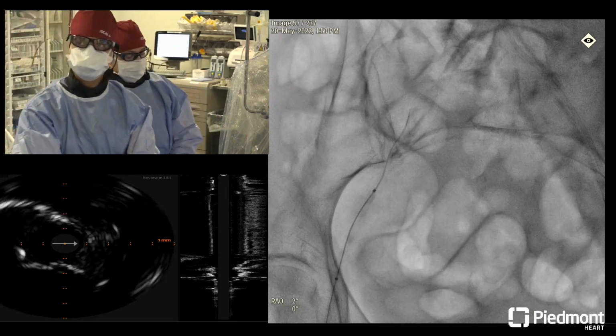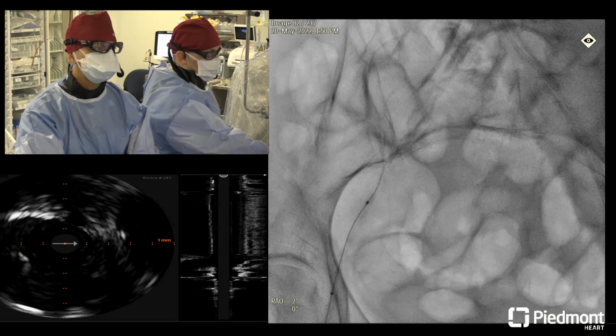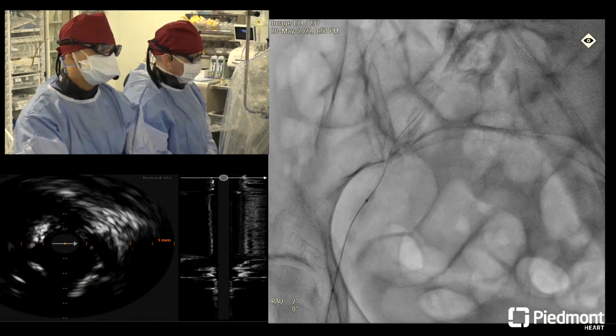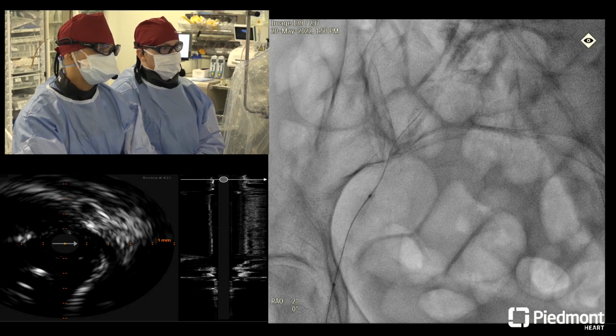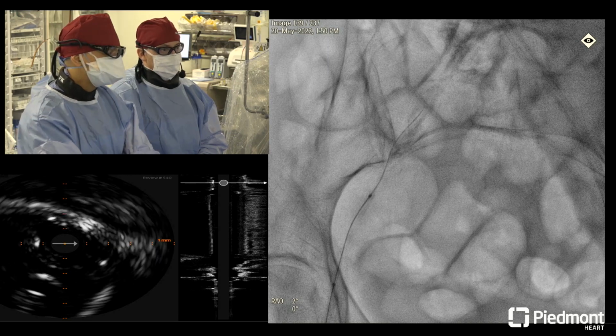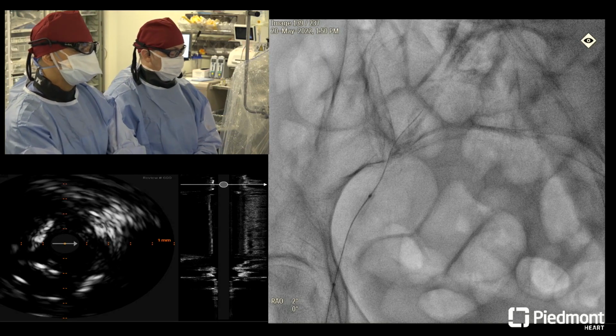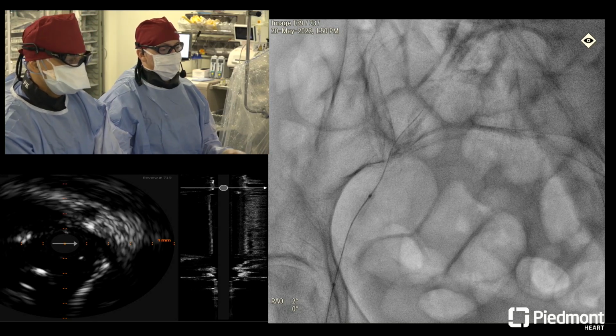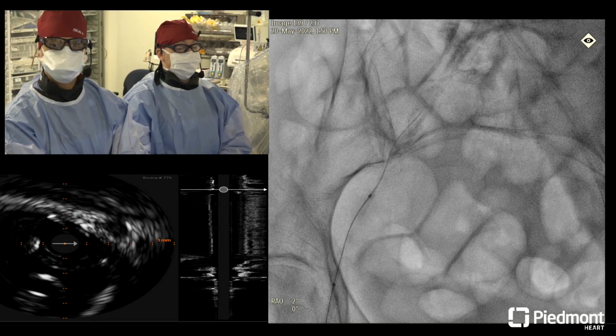So you all did have the right radial for the diagnostic angiogram. Did you consider reaccessing that and then taking an R to P down that way for an additional retrograde shot at the stump? I'm sure you considered it. Yeah, no, I did actually. If you'll notice, I actually have the right radial prepped. When I did it was with a 4 French sheath, and it was pretty tight.